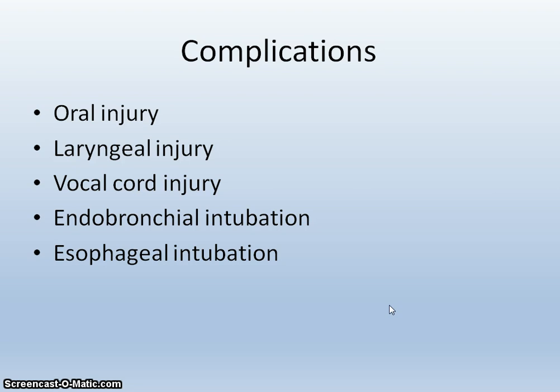The other way esophageal intubation can happen is during movement. Initially the tube went into the trachea, but because of movement, log rolling, turning, and so forth, the tube got dislodged and goes into the pharynx and becomes an esophageal intubation.